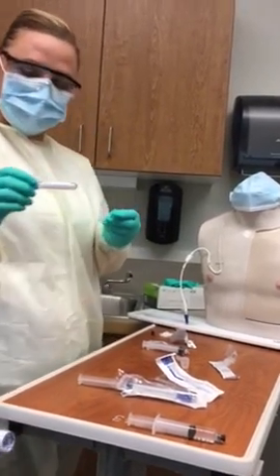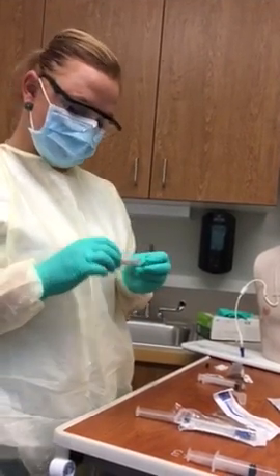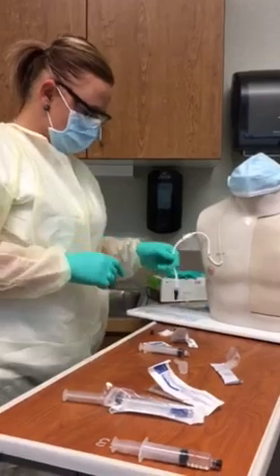I'm going to put your label on it. I'm going to verify your name and date of birth and make sure that it's you. I'm going to put my initials on it. I'm going to time and date it. And then I'm going to get this sent down to lab. Great. Alright, so we got that sent. So now we just got to finish up here.